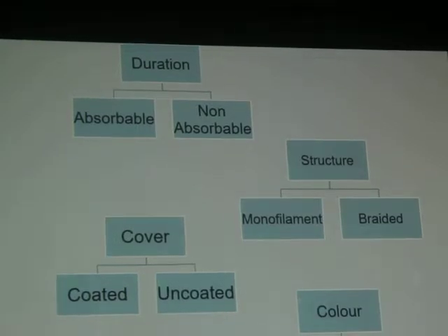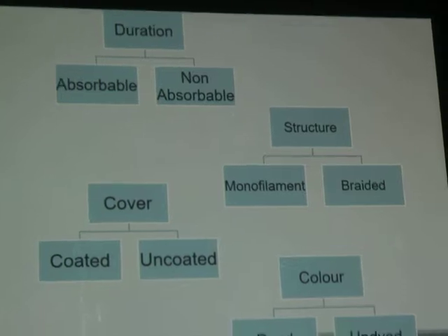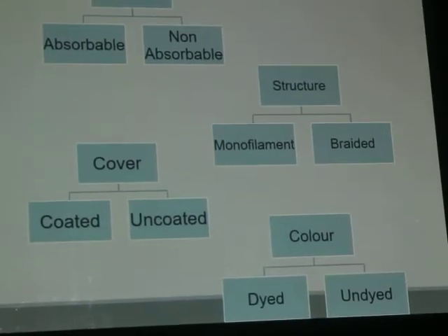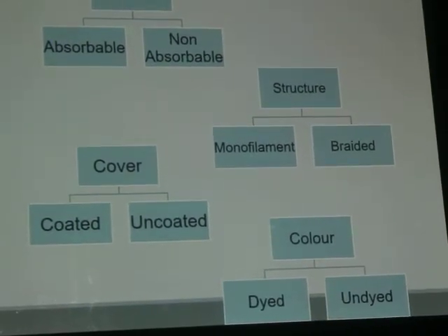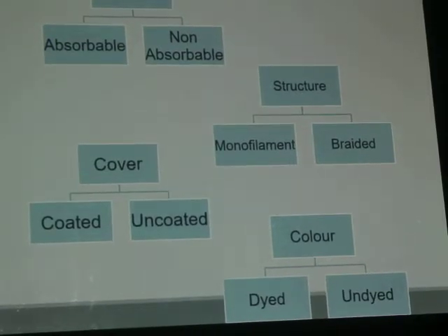ثالث حاجه والاخيره it can be colored. ممكن ادي للسوتشر كلر معين، ممكن يبقى colorless dyed or undyed. والداي هنا اهو does not change the suture properties.